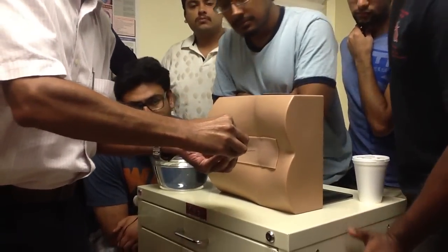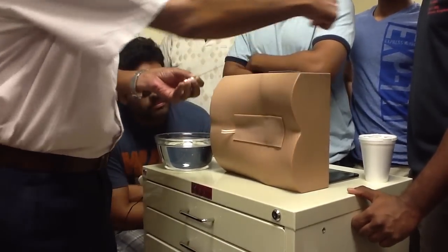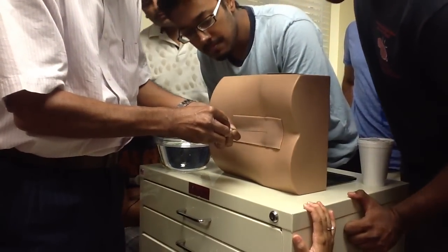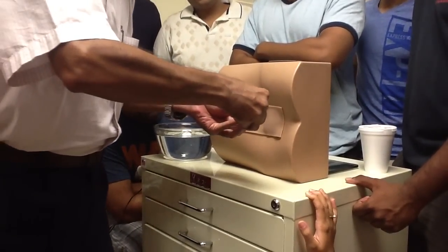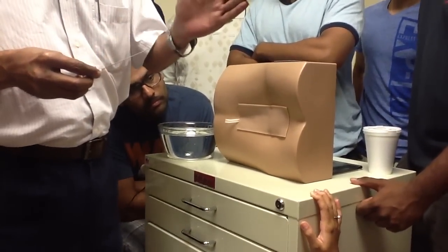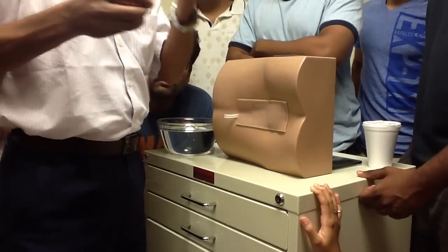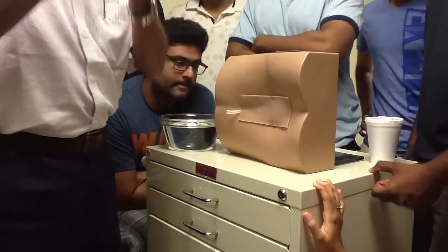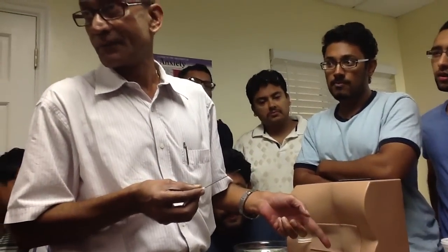In actual humans, you will direct the needle slightly towards the umbilicus. But in this mannequin, the openings in the vertebral canal are positioned a little obliquely — a manufacturing defect — so you have to go slightly in the opposite direction. You'll go through the skin, subcutaneous tissue, supraspinous ligament, interspinous ligament, ligamentum flavum, and the extradural space. After that, you'll reach the combined dura and arachnoid. You will actually feel and hear a pop when you go through it — all of you will be able to see and hear it.